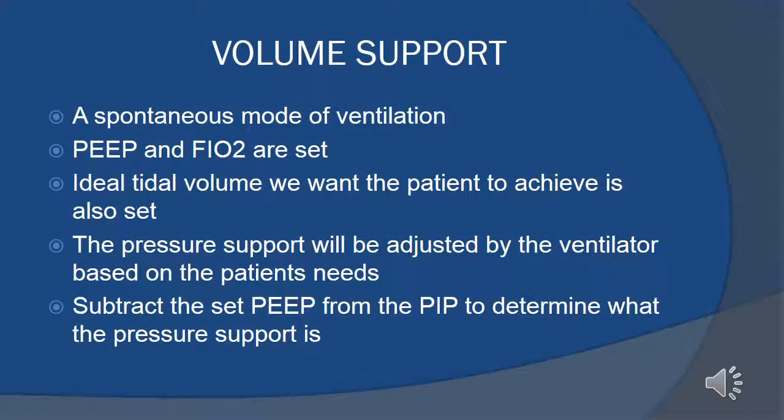Now, the last mode of ventilation that we're going to cover during this whole series of basic ventilator modes is volume support. Now, this is also a spontaneous mode of ventilation similar to pressure support, but it works kind of like PRVC does, except in the support world. So what happens in this mode is we put the patient in this mode. Instead of setting a pressure support, we're going to set a targeted tidal volume. In other words, a tidal volume we want the patient to achieve with each spontaneous breath.